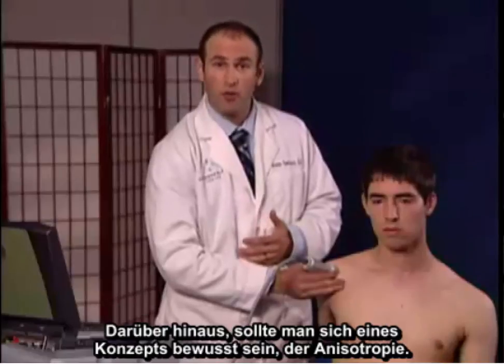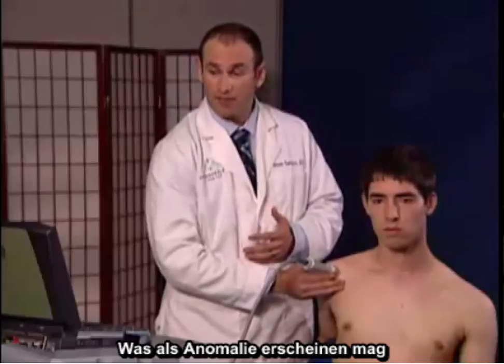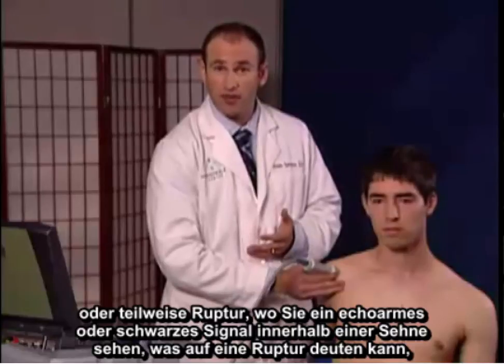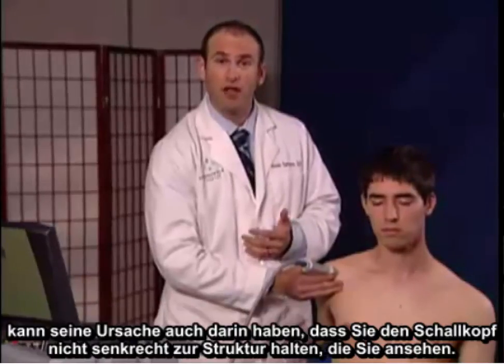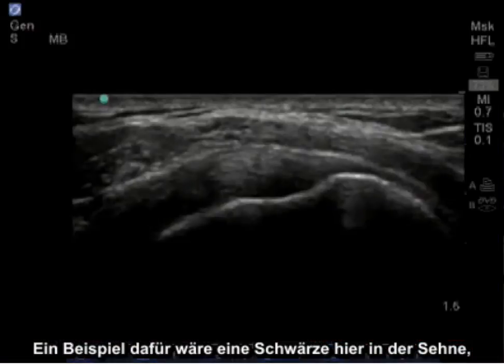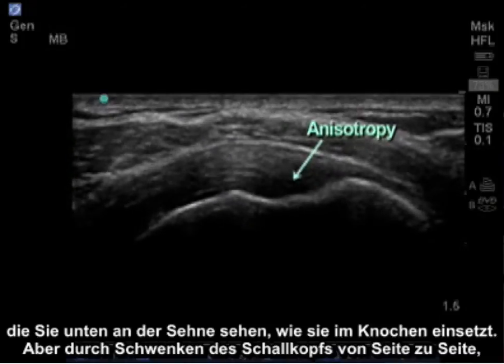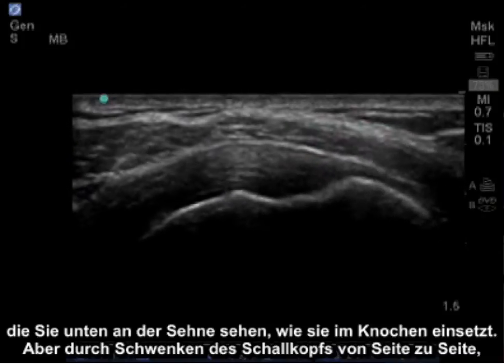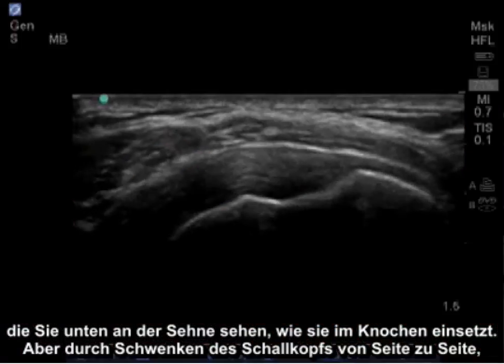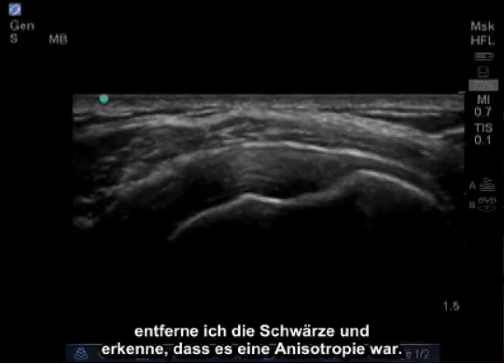Additionally, one pearl to be aware of is a concept called anisotropy. What may appear to be an abnormality or a partial tear — where you can see a hypoechoic or black signal within a tendon that may suggest a tear — was really just a result of your probe not being perpendicular to the structure you're viewing. An example would be a blackness in the tendon on the bottom aspect as it inserts on the bone, but by rocking the probe side to side, I removed the blackness and realized that it was anisotropy.